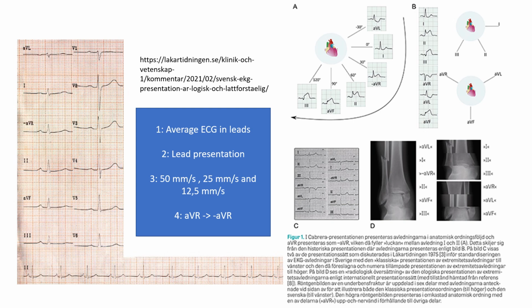So if you have a non-polymorphic ECG, then that's all right. But if you have a polymorphic ECG where the QRS complexes are different each time, then you will get some kind of average, and that's less good. But in most cases, you have some noise, that'll be canceled out and you'll get a crisp, good-looking ECG. So I think that's the reason why they did it like that.